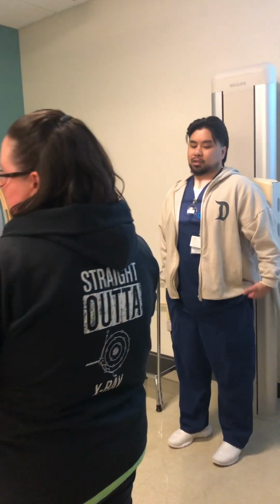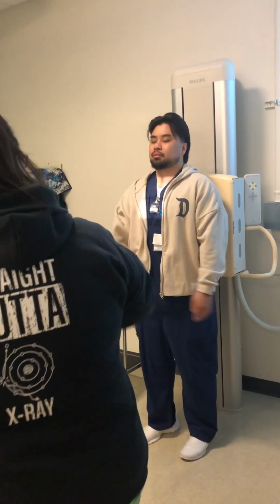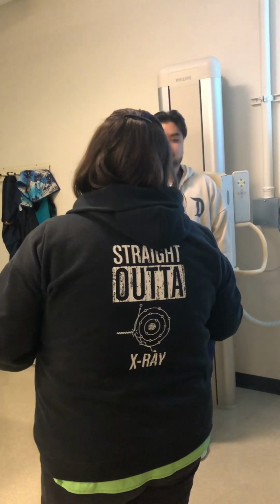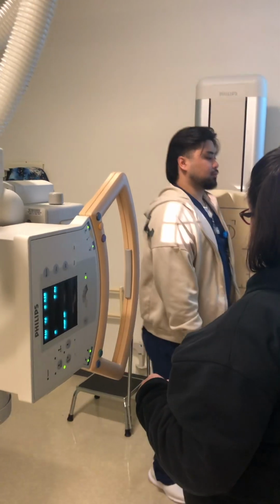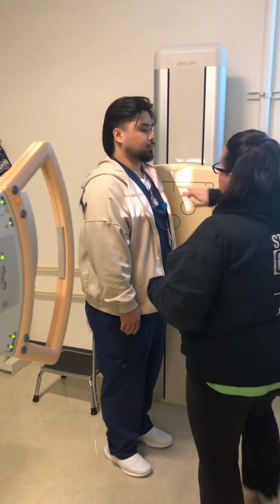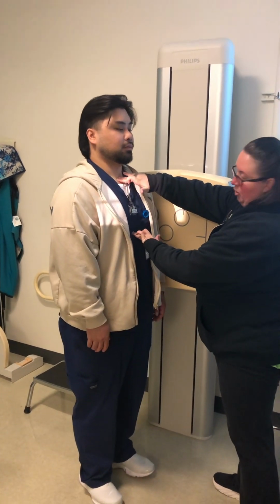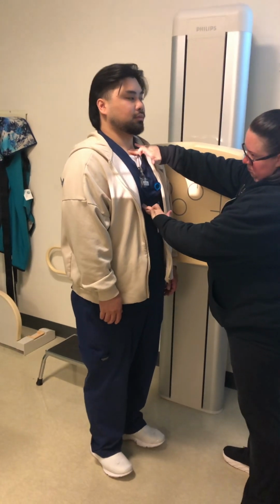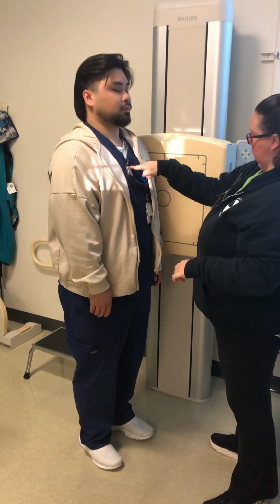All right. So you're going to turn to your left first. Yeah, good. And go ahead and take a step back. A little more. All right. So you're going to find the jugular notch. You're going to find the xiphoid process, right there. And then the midpoint between the 2.